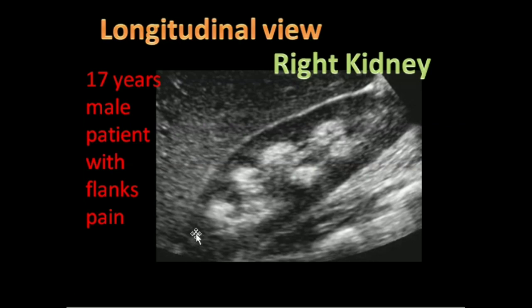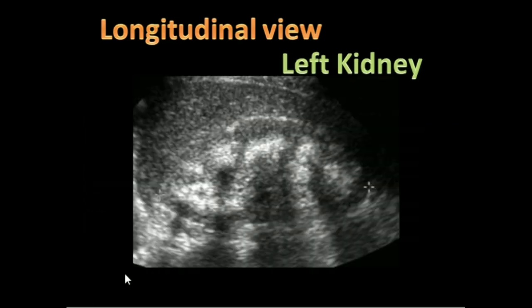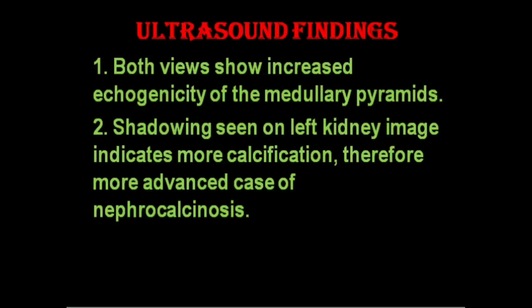This is the image of the right kidney, the longitudinal view. This image is also the longitudinal view of the left kidney. Both images show increased echogenicity of the medullary pyramids.